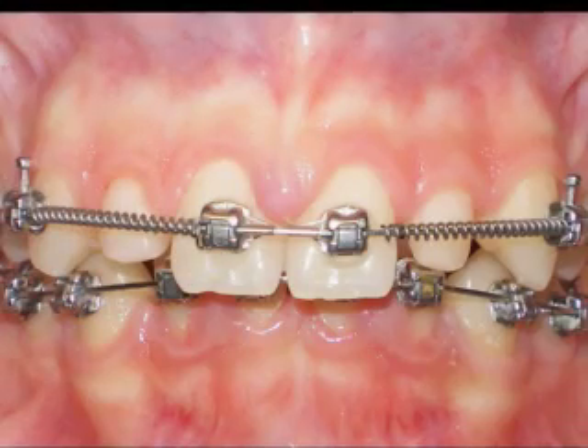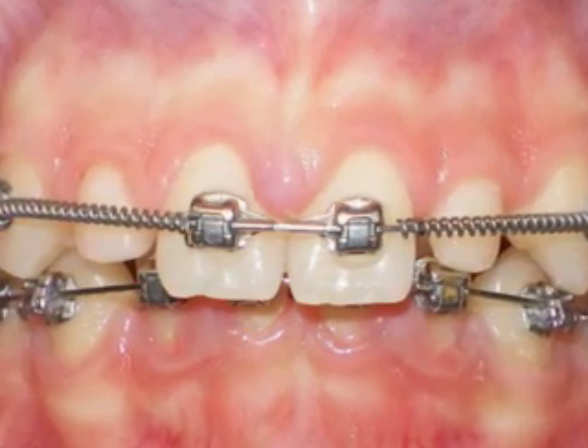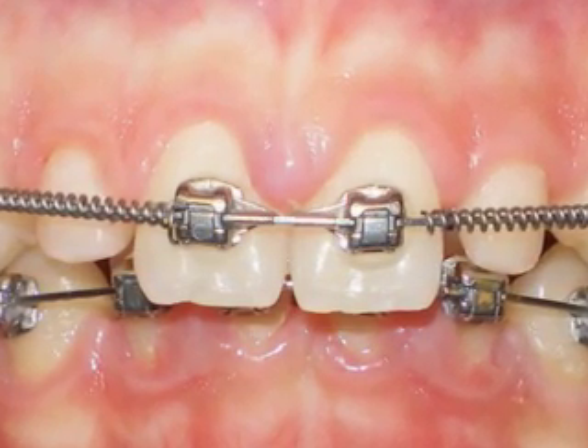In this presentation, we'll take you through the clinical process of creating beautiful veneers over exceedingly small or peg-shaped upper lateral incisors. Of course, the first order of business is to create adequate space to be able to apply the composite veneers.